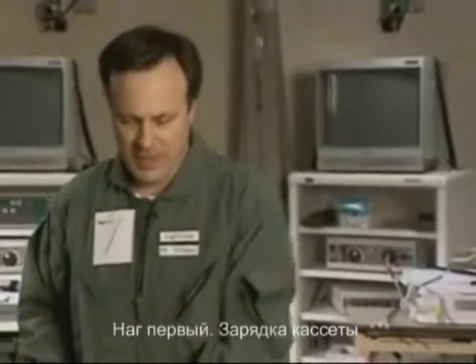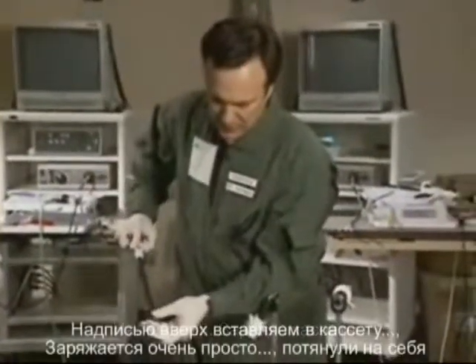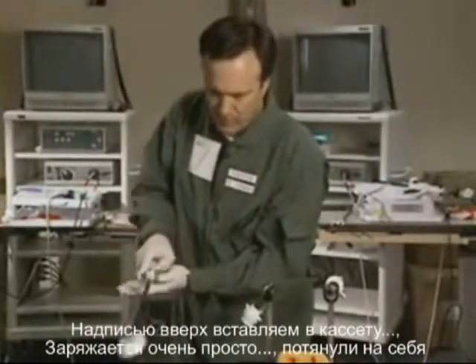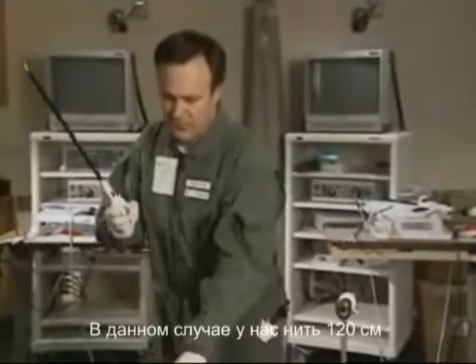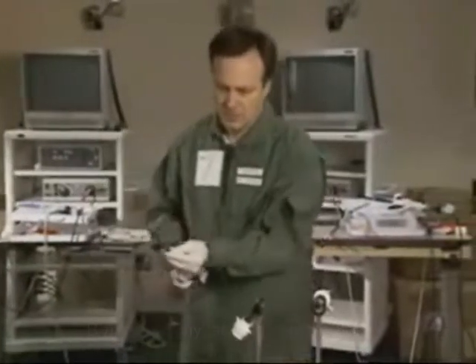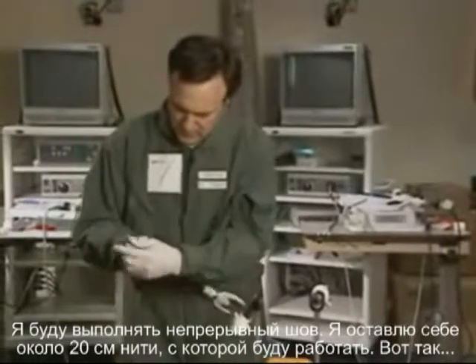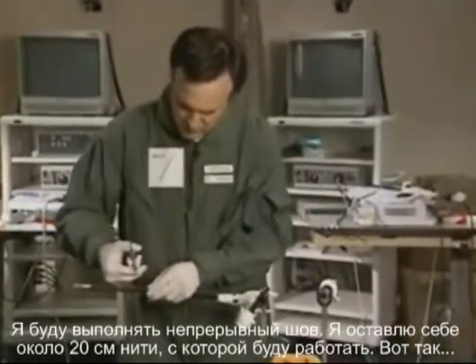Step one: load the instrument. The end of stitch pops right in — it loads very simply. Pull back. In this case, I have the 48-inch suture. Since I'll be doing a running stitch, I'll give myself about nine inches or so of suture to work with.